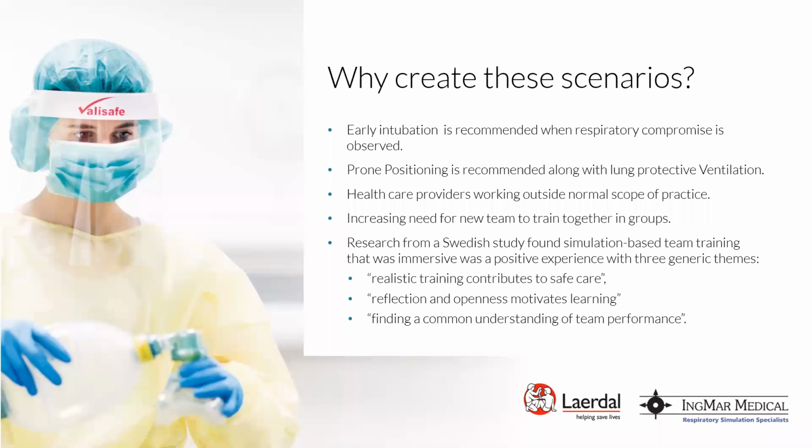Thanks, Jess. When we started out with creating these scenarios, we were very lucky to speak to some staff in China. Peter Su from Sir Runrun Hospital in China has treated over 1,000 patients at their local hospital, and he provided us similar insights. If they had their time again, early intubation and prone positioning would be things that they would have done differently.